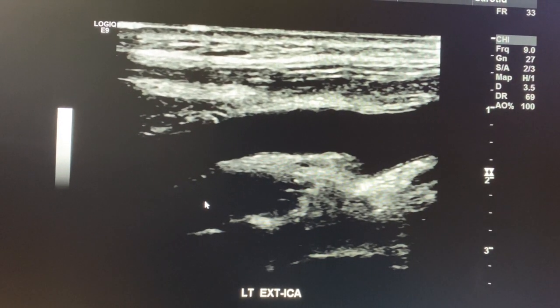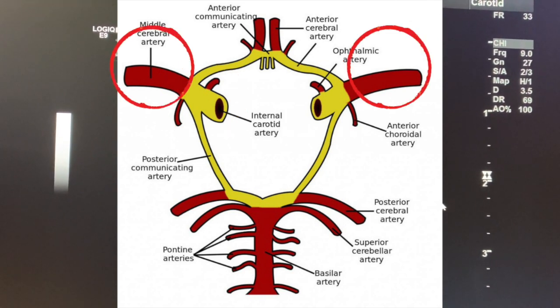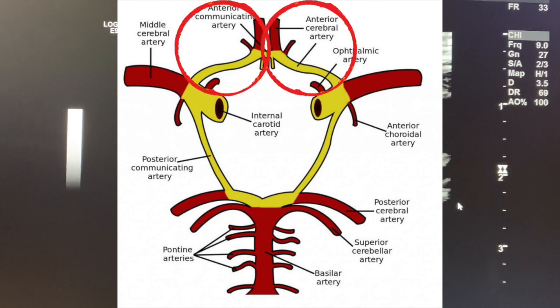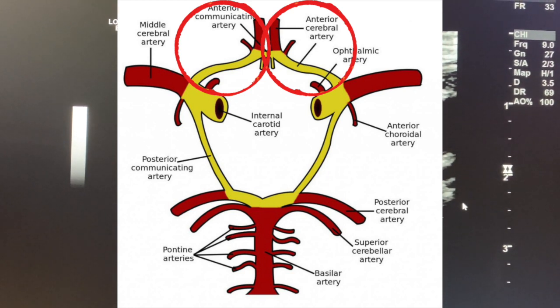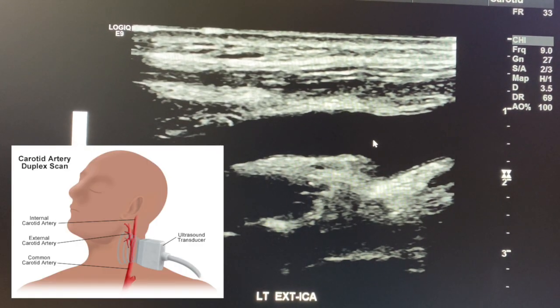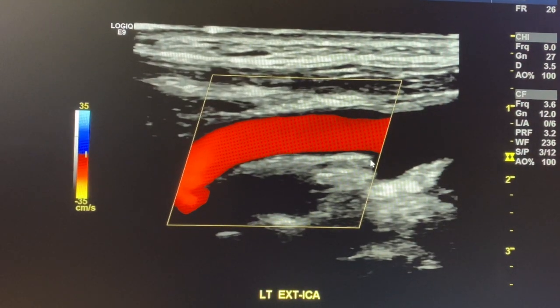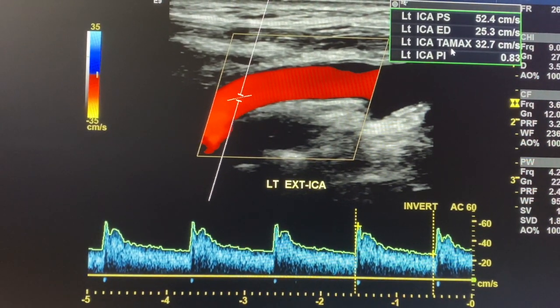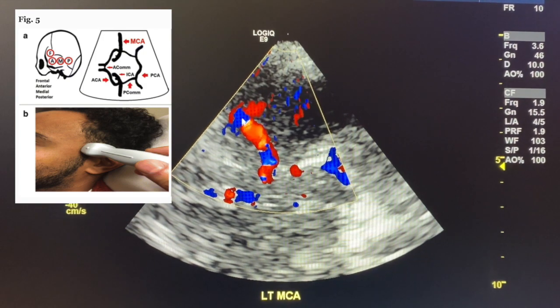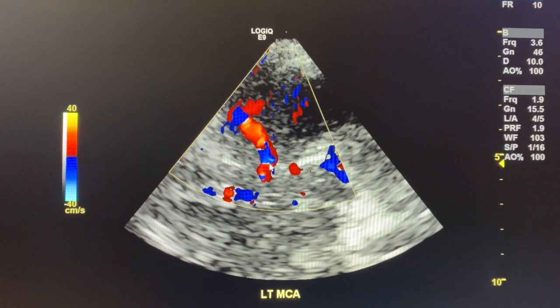Our hospital protocol looks at both the left and right ICAs, the right and left MCAs (middle cerebral arteries), the right and left ACAs (anterior cerebral arteries), and then the basilar and vertebral arteries. Starting on the left side — left ICA in black and white, color, and Doppler to see the flow. We look at the T-max, then move to the left MCA. It's kind of a swirly, squiggly line and we Doppler the whole thing going from top to bottom, surveying the vessel.